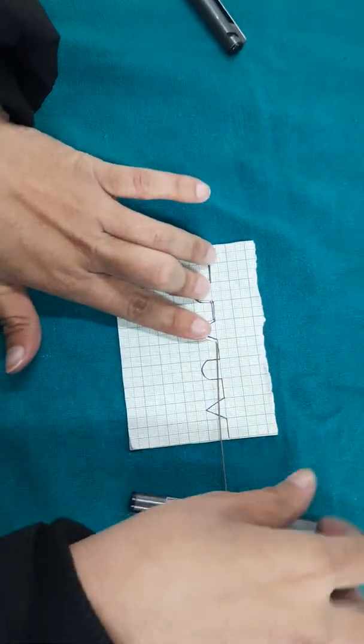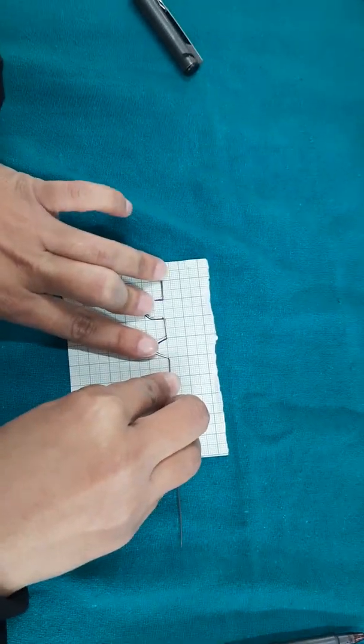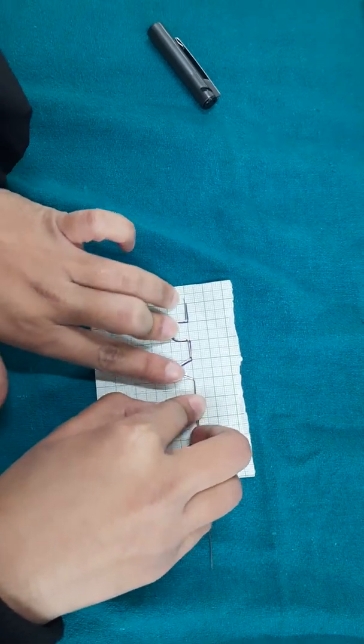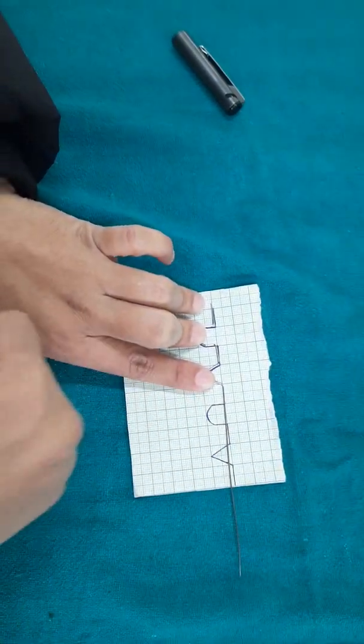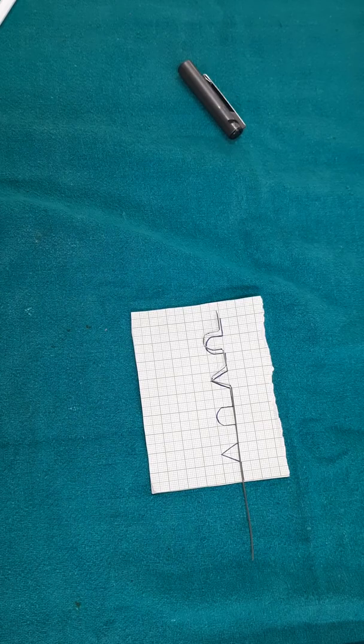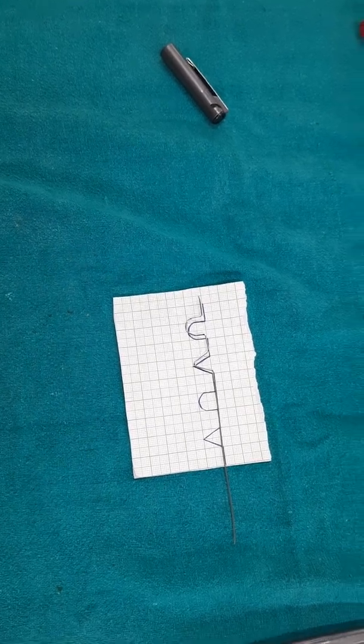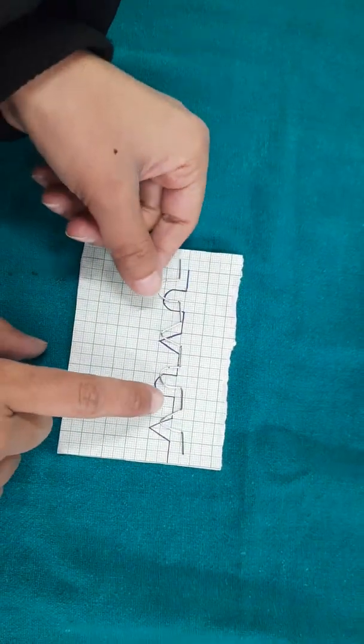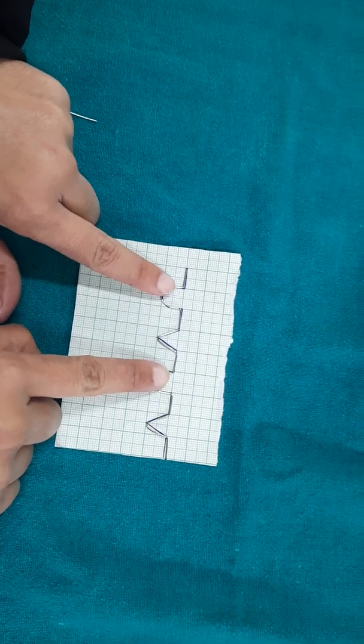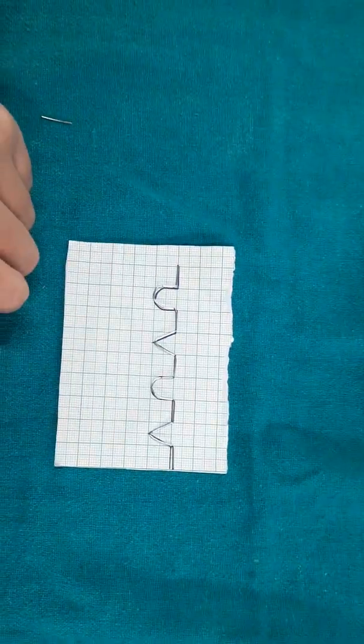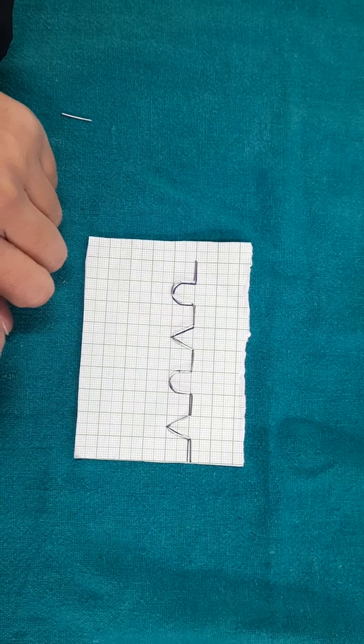Now again adjust the wire on the graph paper. Now another set of U and V in the same manner. Now adjust the U and V on the graph paper and you can see the U and V from all the sides.